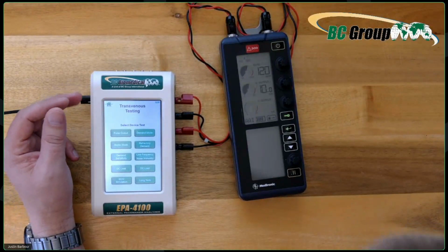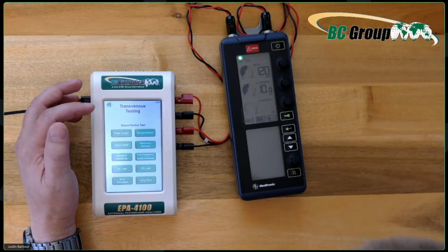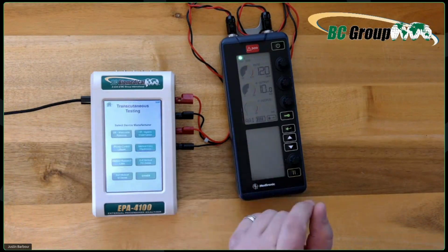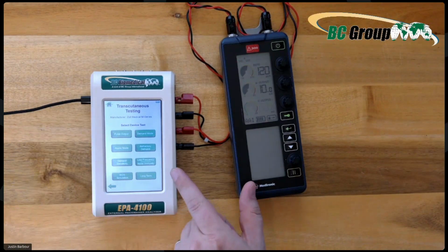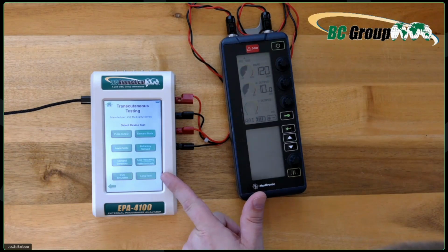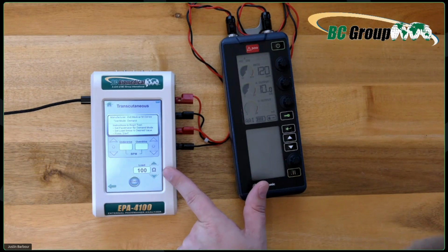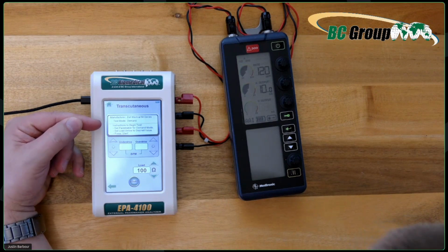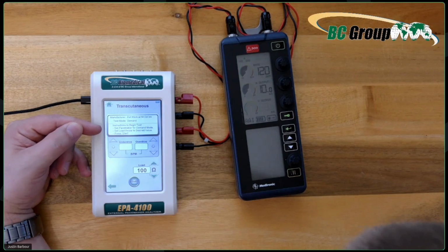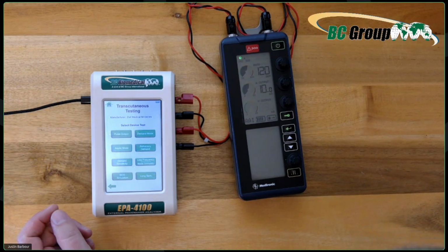This guy is brand new. I've only had it in my hands about 3 or 4 days, and since then, it already has had one software update. Pretty cool stuff to see a product come into what it should be. Let's go into, let's say, Zoll, and here you can see that there's a few less items when you're doing transcutaneous. Nonetheless, you have all your ohms loads, and they are pre-configured according to the model. And you'll also get some simple instructions right here. Like it says, set pacemaker for demand mode, set load below to desired level, and then hit start, and you would do that. So just follow it along.